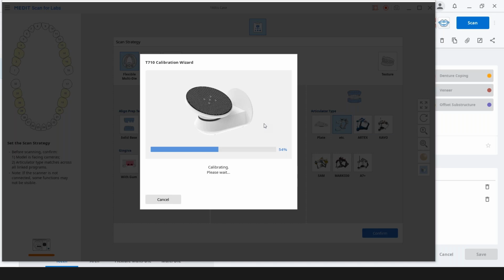That's one thing I really like about Medit, it gives you options basically, so you can choose what's best. So I know with the iOS scanner, the default is 14 days. After working with a lot of doctors, they like to just calibrate maybe Monday morning or Friday afternoon, get the calibration complete and ready to go for the week, so they know that it's calibrated correctly. And it's nice having the options, I think is the good part. Right. And even though the picture shown on the screen is stagnant, it's not moving, it's stationary, the scanner obviously is moving.